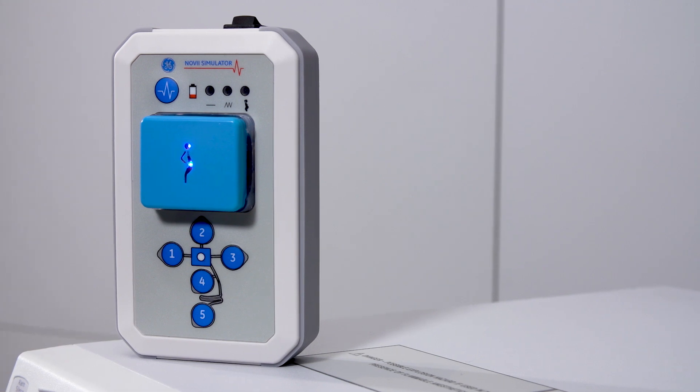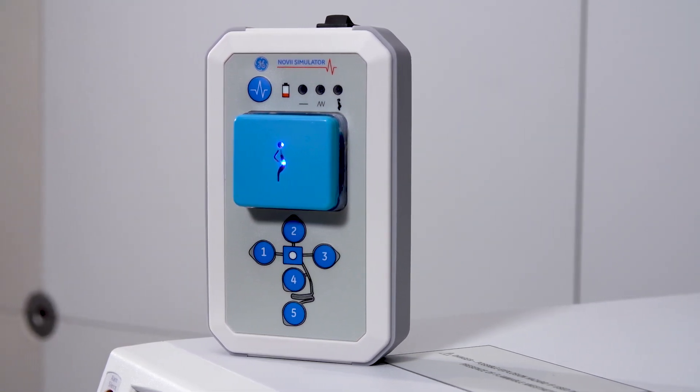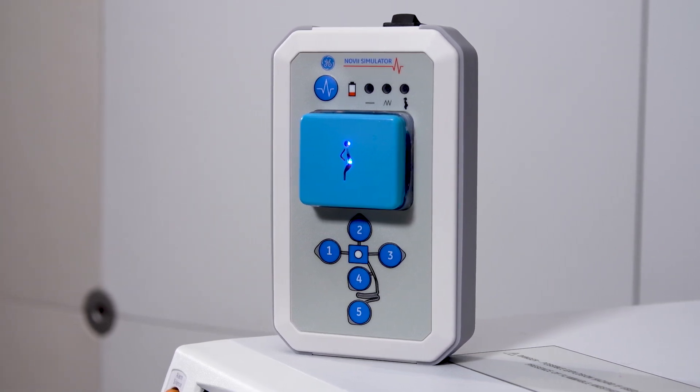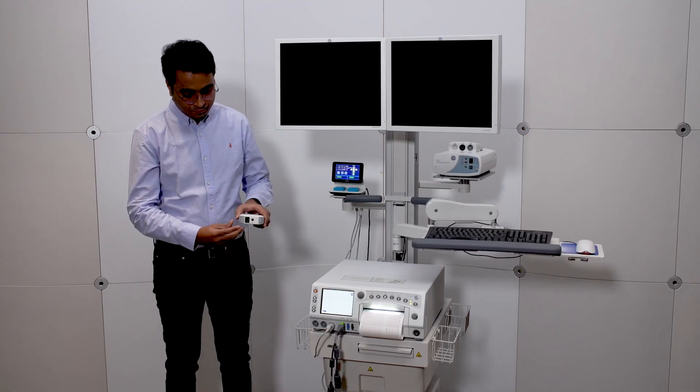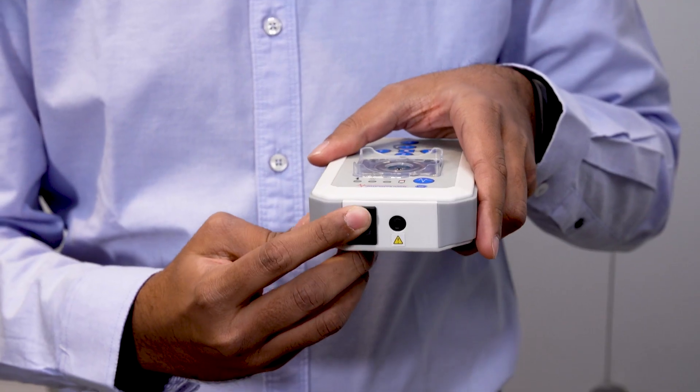The Novi Simulator, with its different modes and features, is used to help troubleshoot Novi pods by simulating maternal heart rate, fetal heart rate, and uterine activity signals in order to rule out pod malfunction concerns. At the top of the simulator is the power switch, which will turn the device on and off, like this.